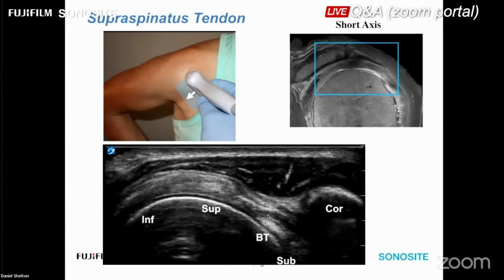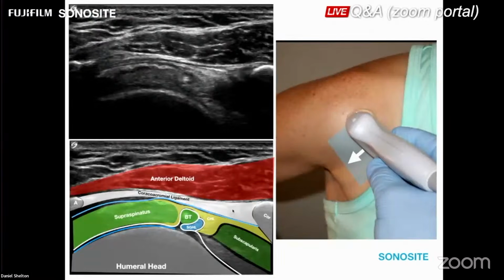There are other structures that we'll talk about toward the end of the slides between the biceps and the supraspinatus. But for now, let's focus on this leading edge of the supraspinatus. That's where all the pathology happens for the most part. Infraspinatus won't be so heavy in this slide deck, but we will discuss it a little bit. But we've cut the rotator cuff in half, and we're looking down the fibers as a sagittal MRI equivalent.